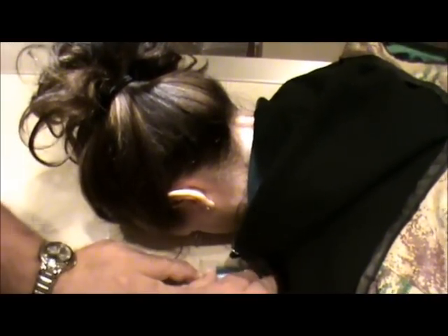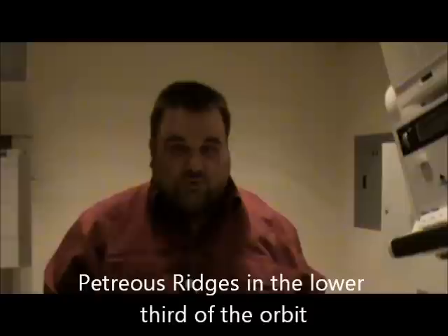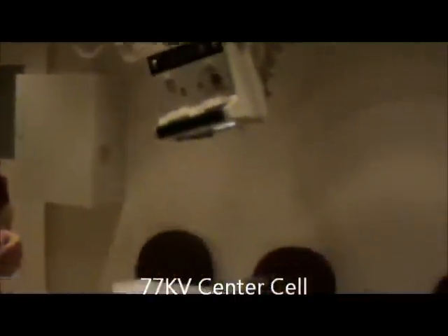I'm going to adjust my collimation in to the skin margin and just a little bit to the top of the head. I'm going to move my pen out. This is her left side, so I'm going to put my left marker right there. In the Caldwell view, we should see the petrous ridges — good head positioning indicates the petrous ridges are in the lower one-third of the orbits. The technique for this will be 77 KV, center cell. This is our Caldwell view for facial bones.